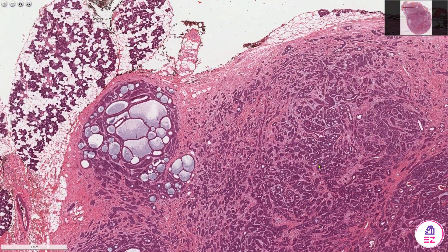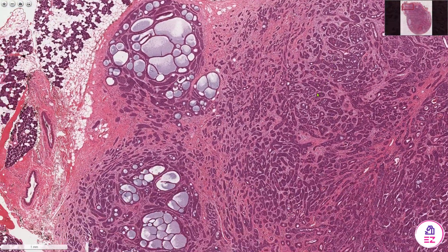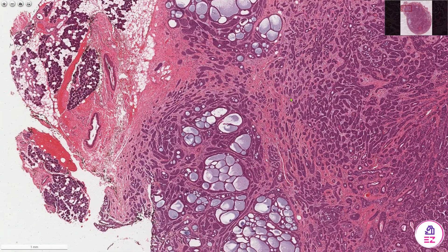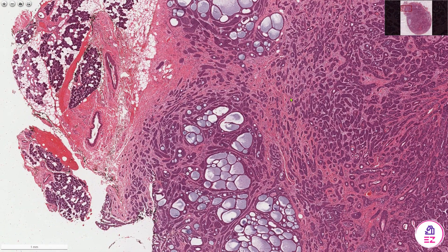This cribriform pattern can get confused with a polymorphous adenocarcinoma, but they are typically negative for P40, unlike the adenoid cystic carcinoma. In addition, adenoid cystic carcinomas have a common translocation which is MYB-NFIB, and sometimes it will have other fusion partners as well, but the most common is MYB-NFIB.